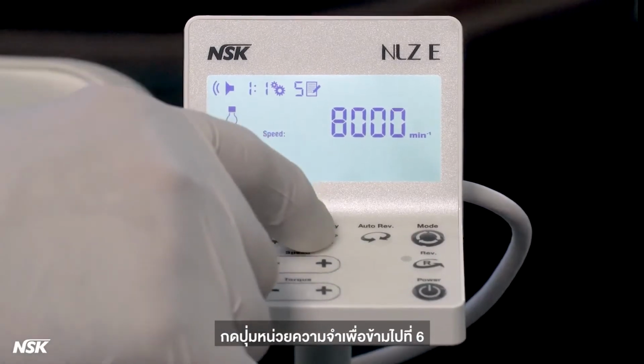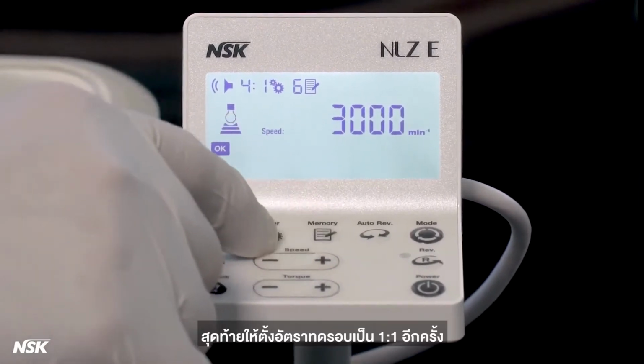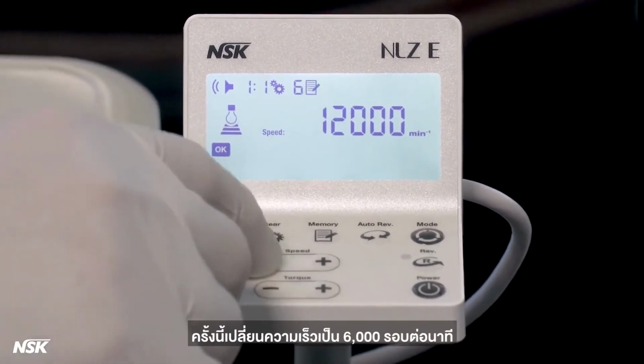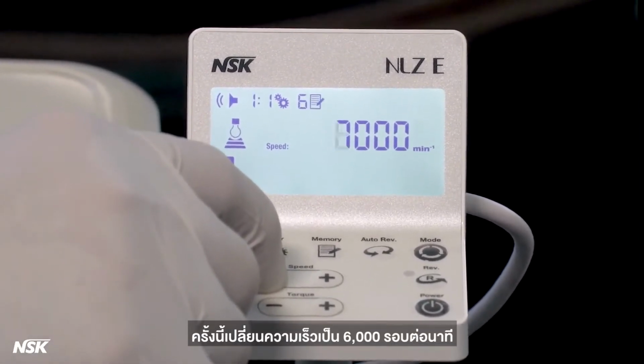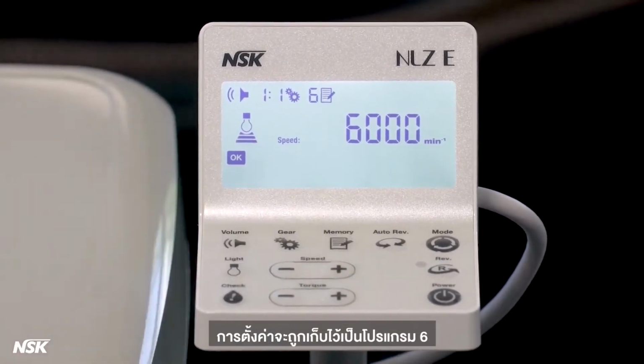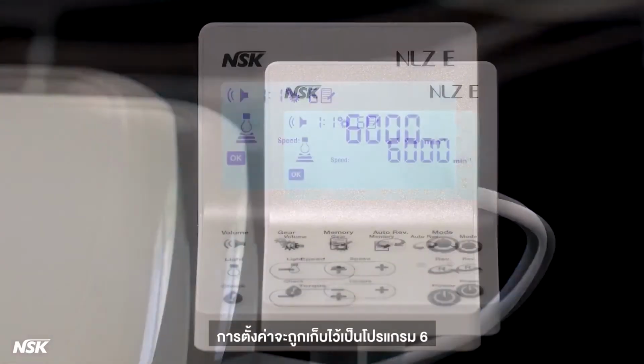Press the memory button to jump to number 6. For the last one, again set the gear ratio to 1-to-1. Change the speed to 6,000 RPM this time. Press and hold the memory button until you hear a beep. The setting is stored as program number 6.